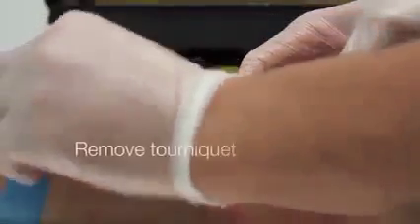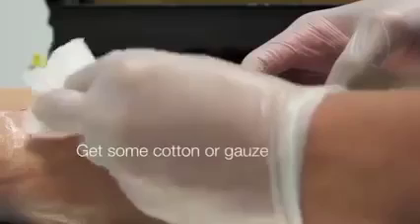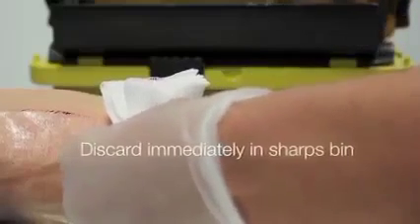Before you take the needle out, remove the tourniquet. Get some cotton wool and cover the site of the needle injection. Then remove the needle.